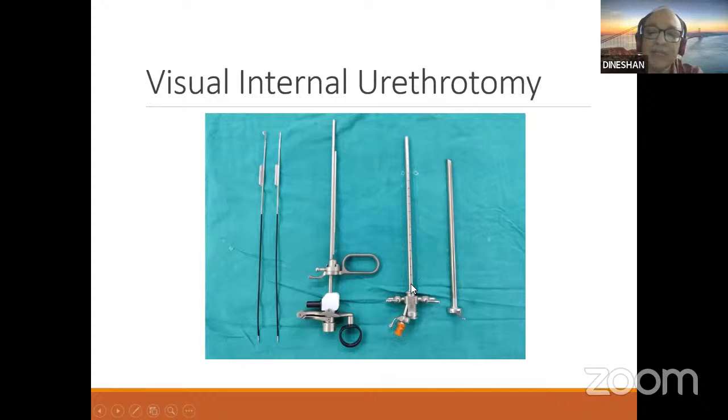And you can see the markings here, 1 centimeter. Here you have all the markings throughout the sheath, and unlike the cystoscope sheath, you have markings only towards the proximal part. Here only you have the markings. The markings are used for measuring in the cystoscope sheath. All these markings are 1 centimeter apart.